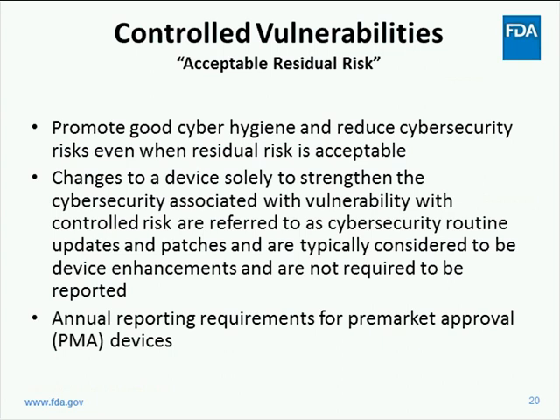The FDA has provided manufacturers with the opportunity to strengthen their cybersecurity through enhancements and minimal oversight when risk of patient harm is controlled, including reduced post-market and pre-market burden. For Class 3 devices, FDA has asked manufacturers to provide cybersecurity changes as part of the annual reporting requirements.